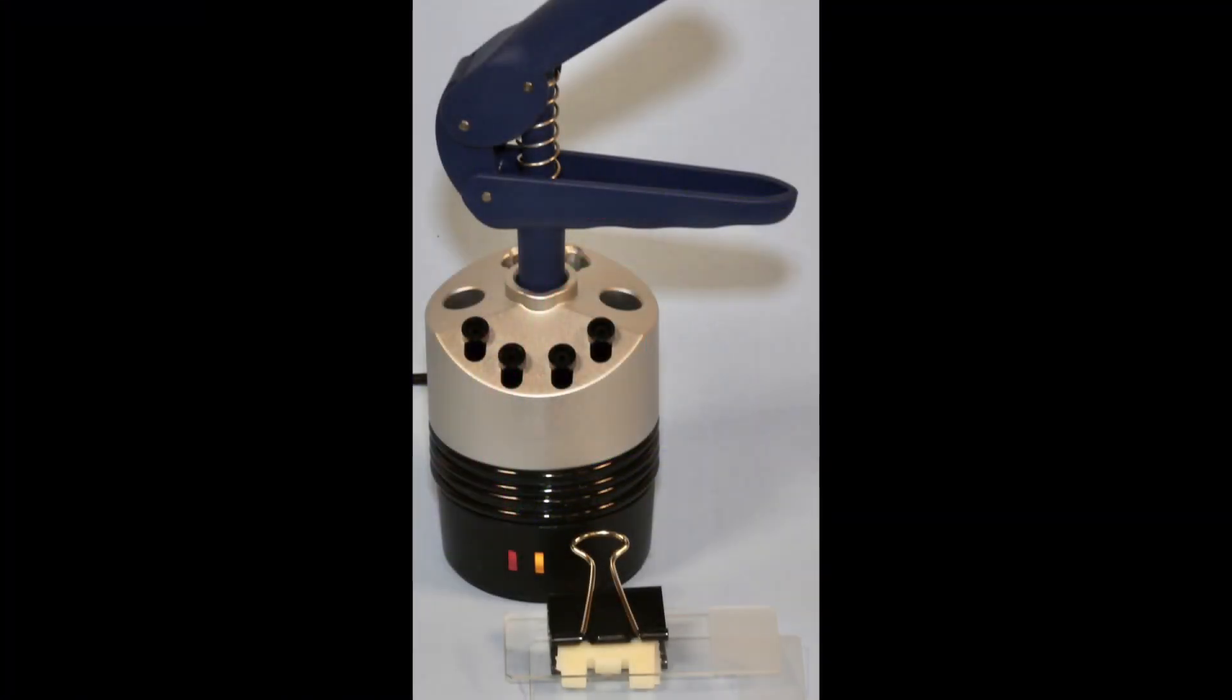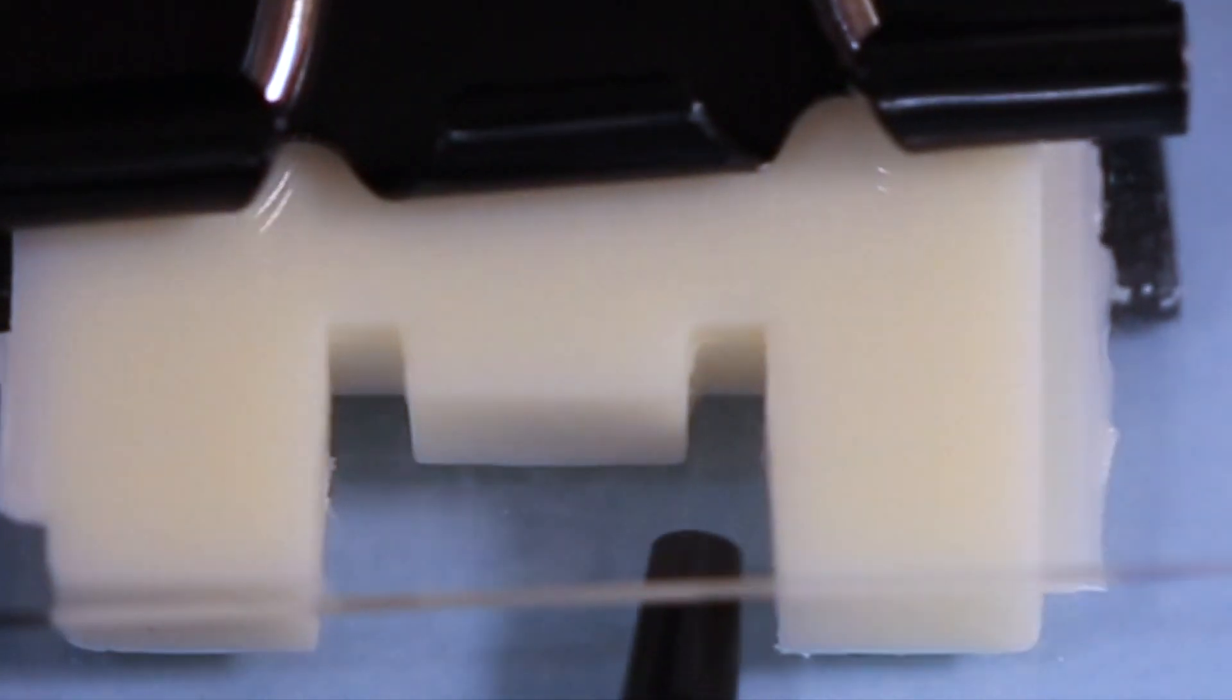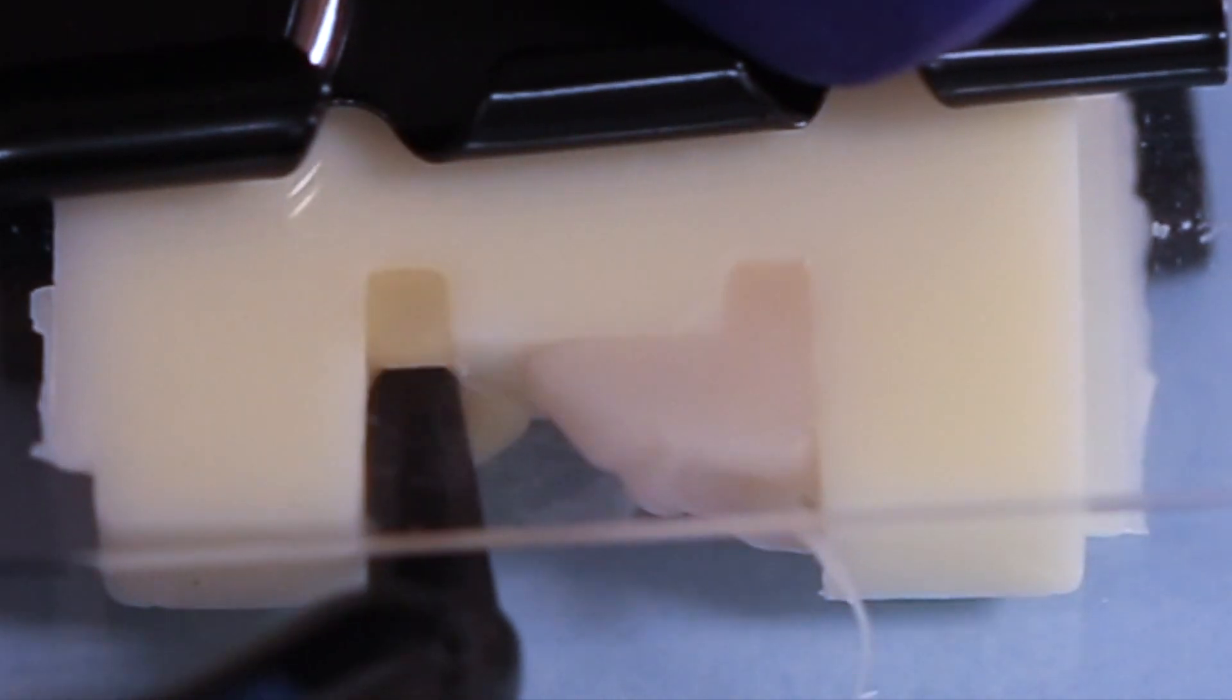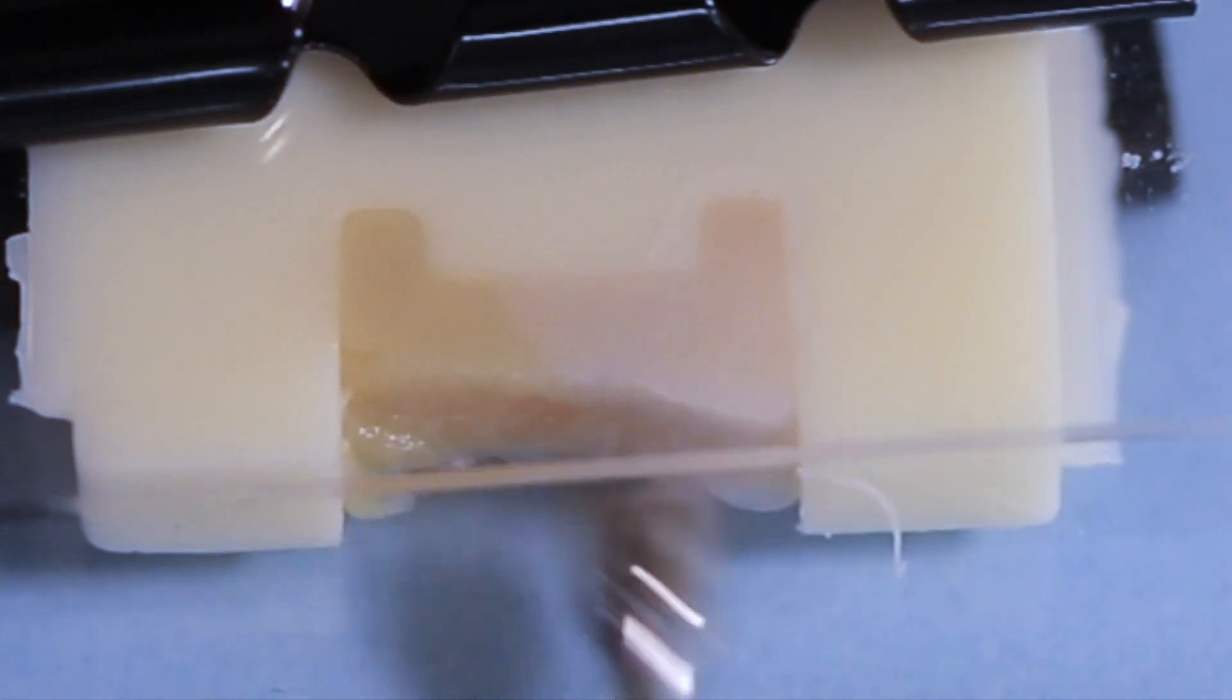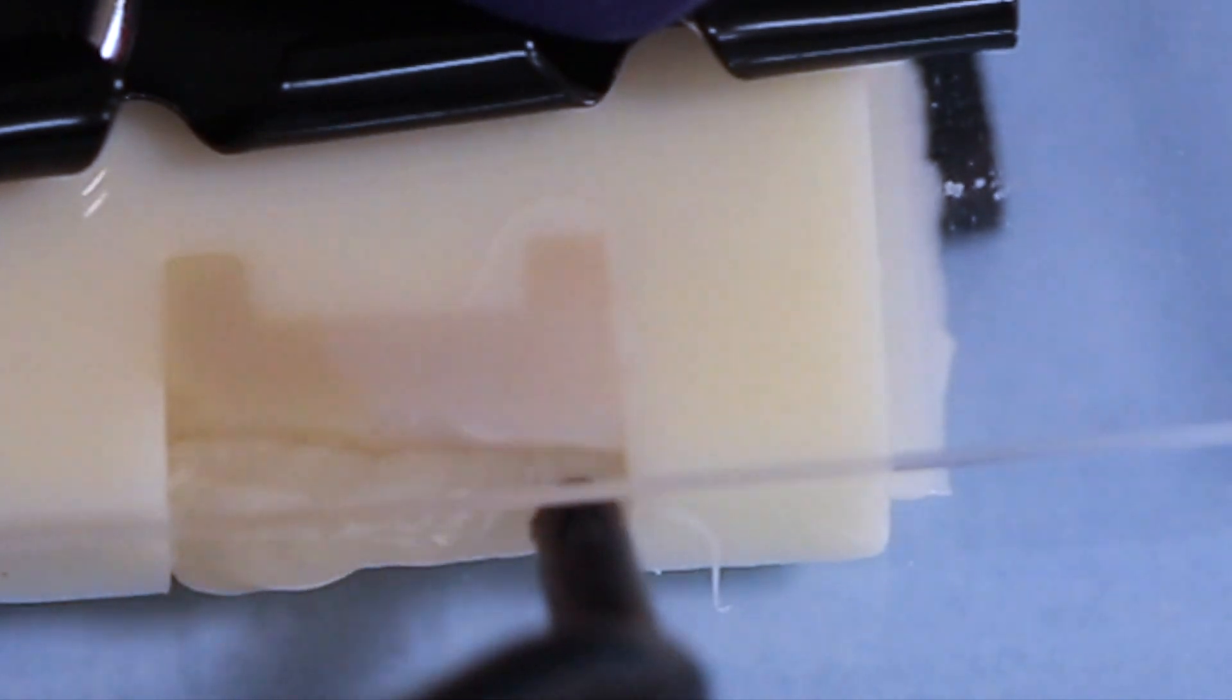Now one way to avoid these voids is to preheat the composite using a composite heater and then to deliberately inject the composite into all the nooks and crannies and not rely upon packing it in.